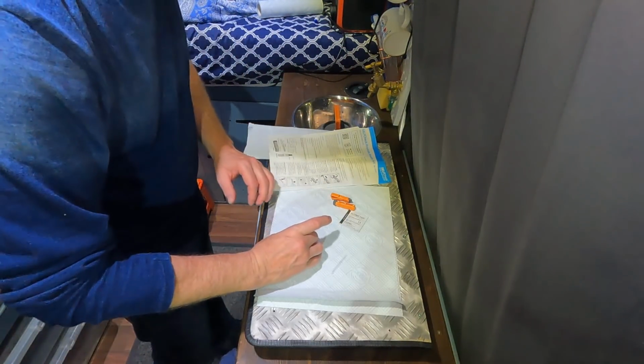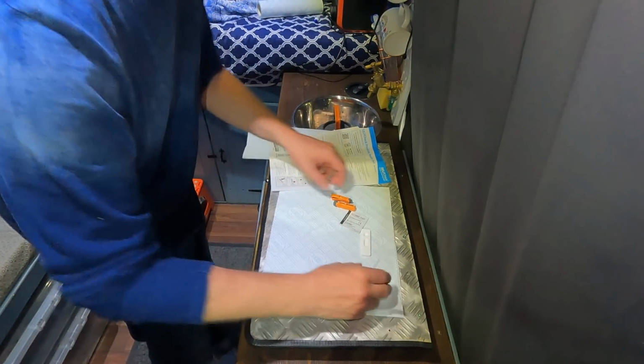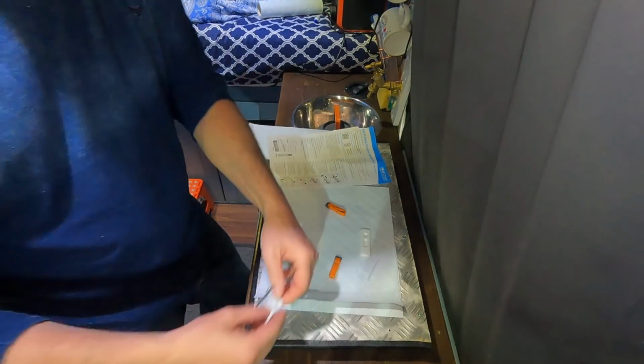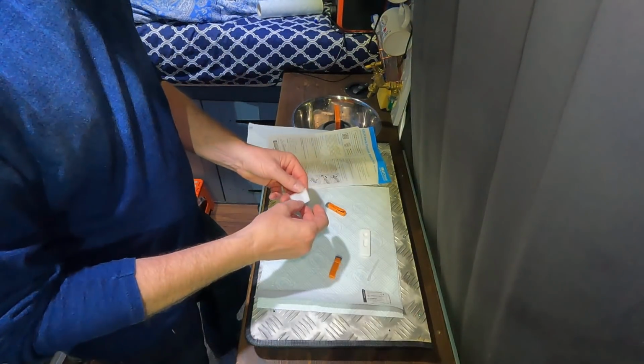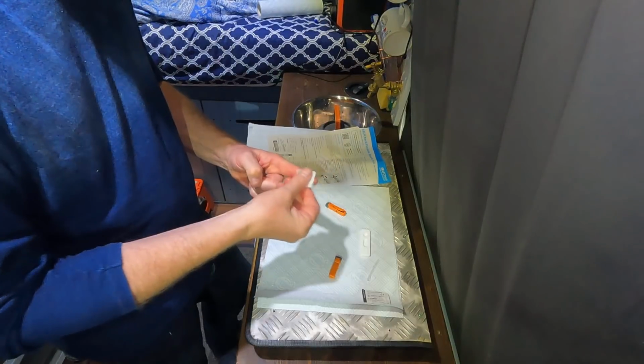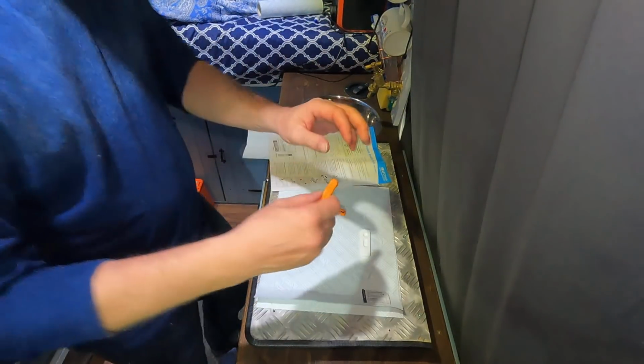So this is our kit. This is our blood sucking device. And these are our prickers. So the thing I've got to do first is clean my finger. Yeah, I guess we'll just use this one. Clean it thoroughly with a bit of alcohol. I'm going to put that to one side in case this doesn't work.